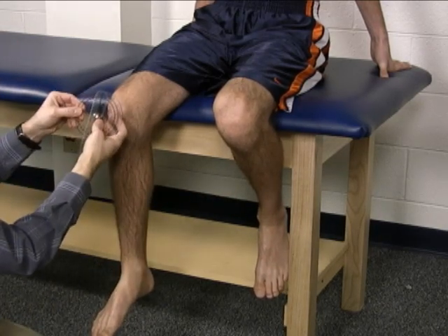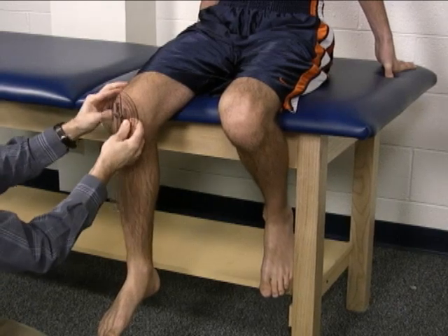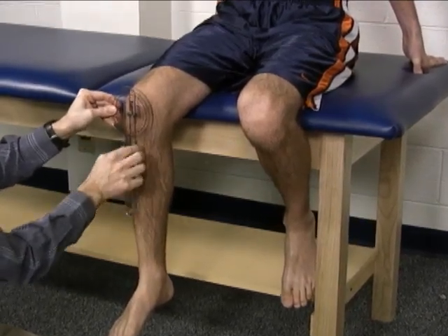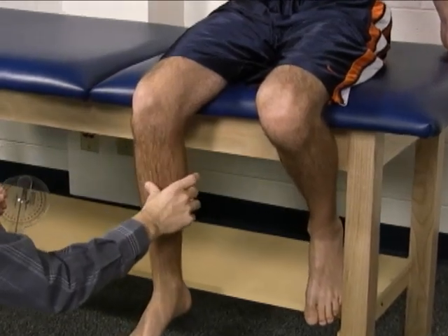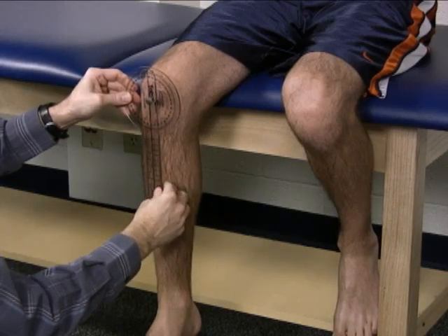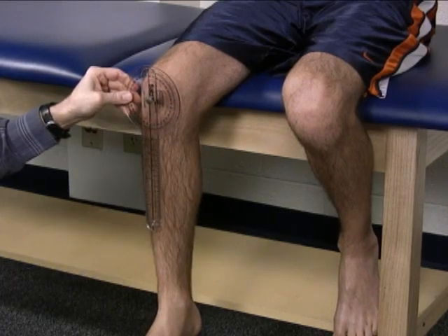The axis of your goniometer is placed over the patella. The stationary arm is simply vertical, and the moving arm is lined up with the anterior ridge of the tibia, which you can palpate. That's your starting position.